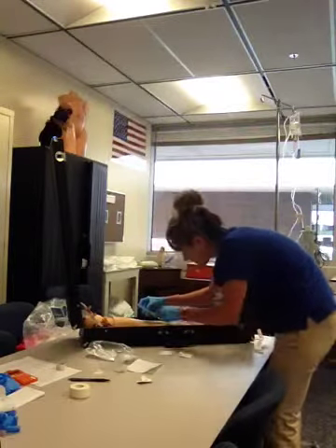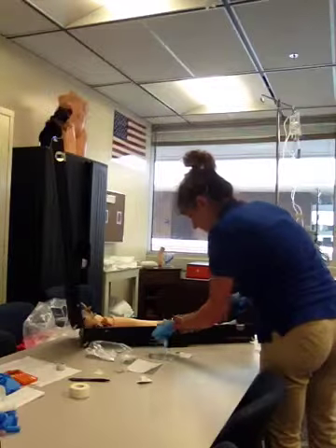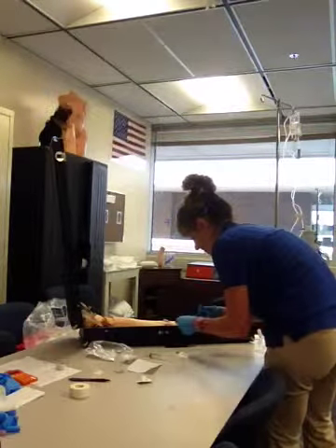Again, I'm going to remove the saline. And now I'm going to clean the port again. Clean the port again. Just open. In a comfortable spot for the patient.